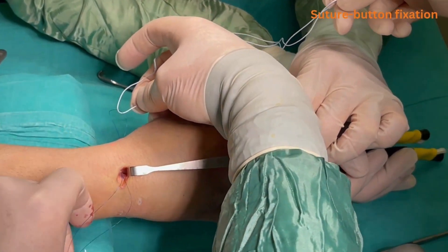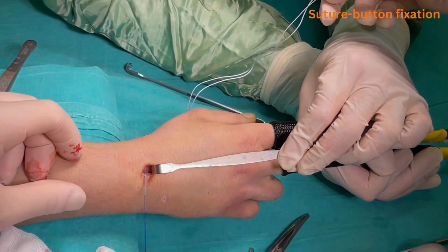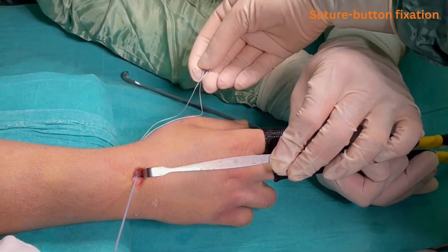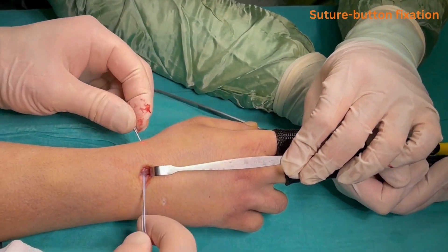The suture button device is passed over the prolene suture. The prolene suture is pulled towards the 3-4 portal, taking the SB device through the tunnel along the scaphoid wire. The first button is anchored on the distal pole of the scaphoid.